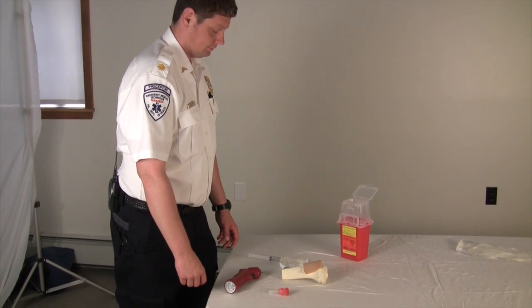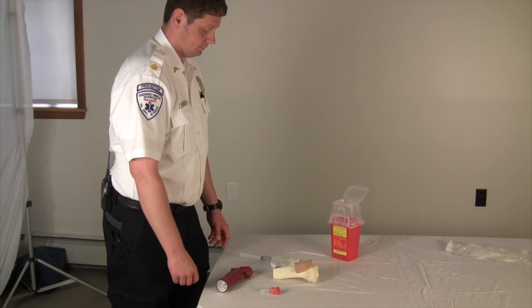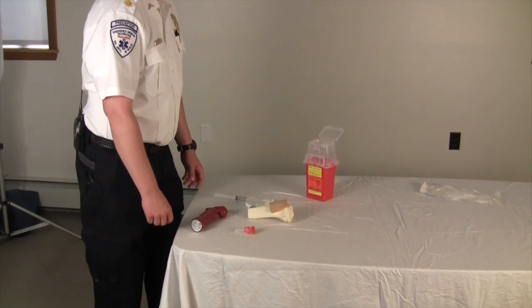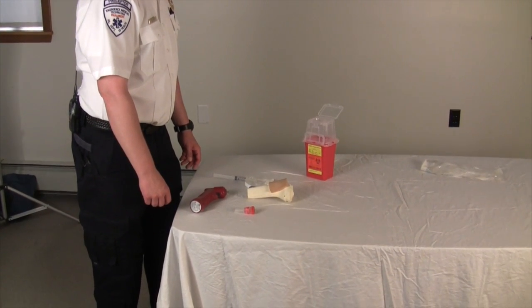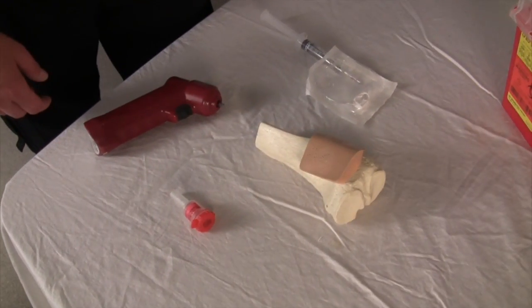IV access in the non-perfusing patient has always been a challenge. To answer that challenge, we've come up with intraosseous medication administration. It's very simply a hollow needle that reaches into the inside of the bone, into the bone marrow, through which you can deliver medication.